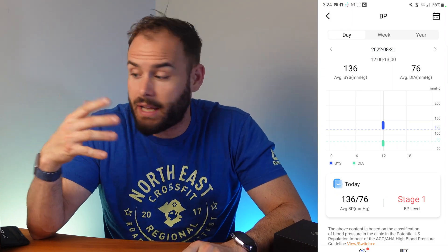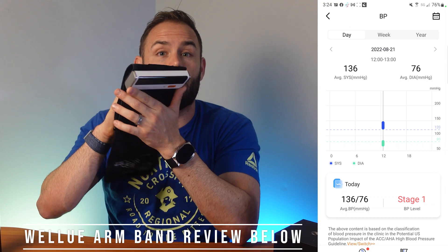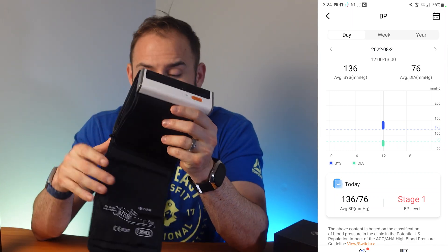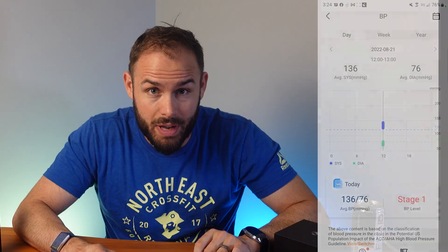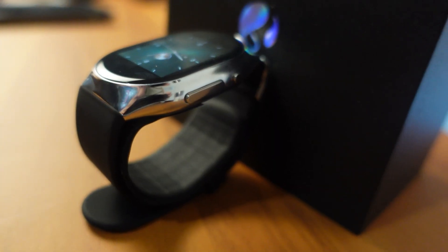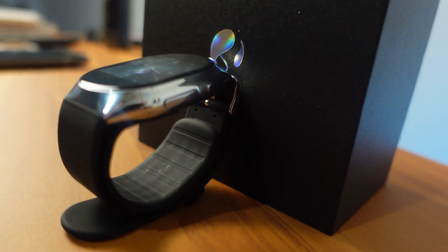After a little more testing, I figured it out — make sure to read the directions. The biggest thing I wasn't doing was elevating my wrist above my chest. For those who have done this before, you know that. Also give yourself a little time to calm down. When I did that, I got a reading around my regular 136 — it's a little high, but that's my regular.